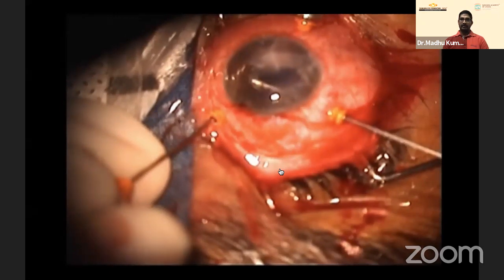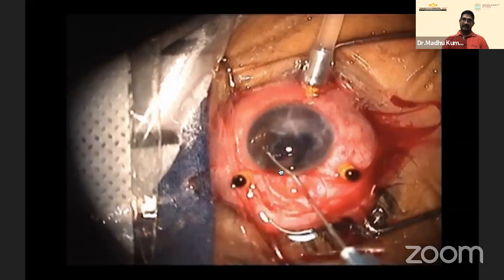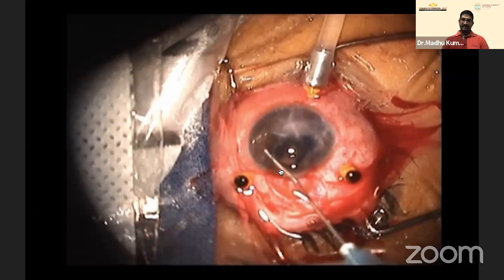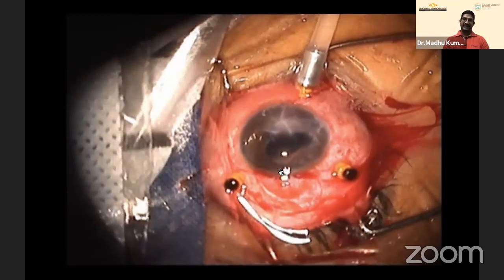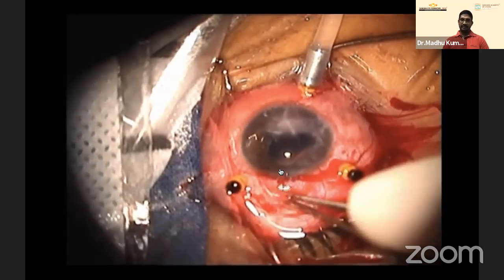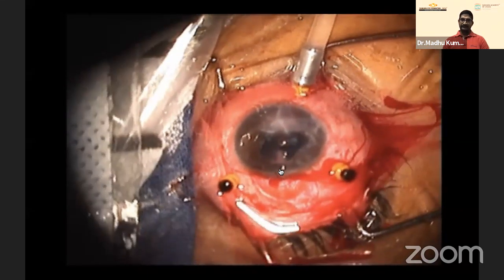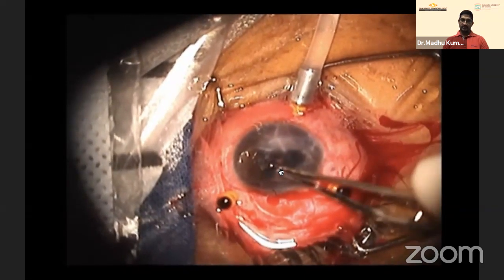Another foreign body was found stuck to the vitreous hemorrhage. One could be lifted with the vitreous cutter in suction mode — not always possible. Glass foreign bodies are very difficult to handle with forceps because they deflect like a ball bearing and cause more injury. The ideal technique is visco-expression: place the foreign body on the iris and use viscoelastic to express it.